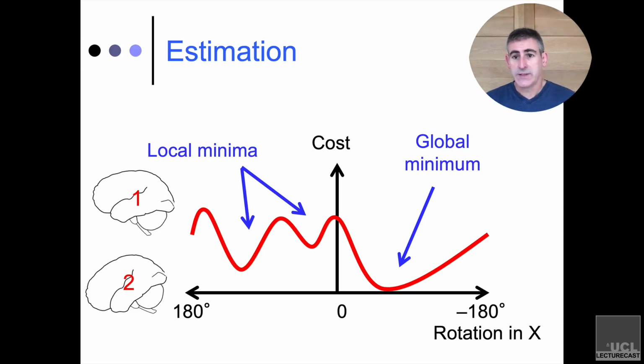And I've only shown this in one of the 6 degrees of freedom, but you can imagine doing this for the other 2 rotations and the other 3 translations, so that you get 6 estimated motion parameters per volume that make the data as unmoving as possible. That's the realignment process.